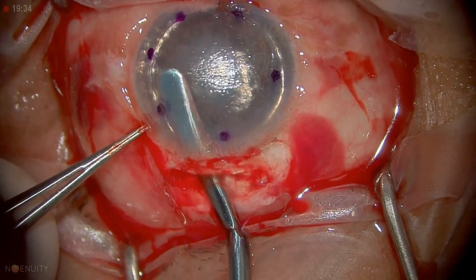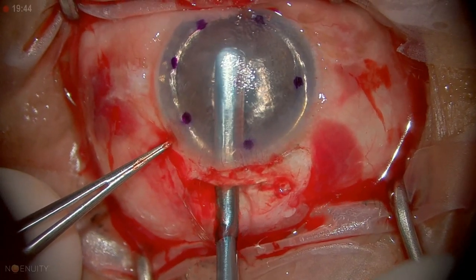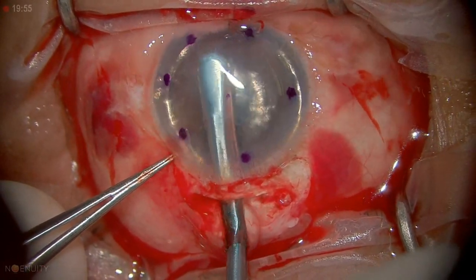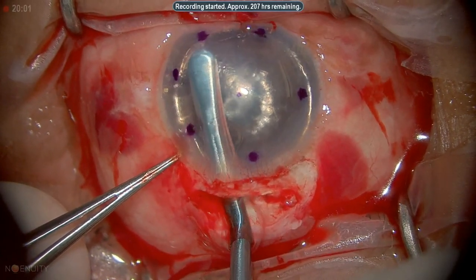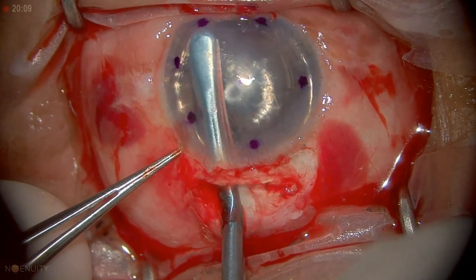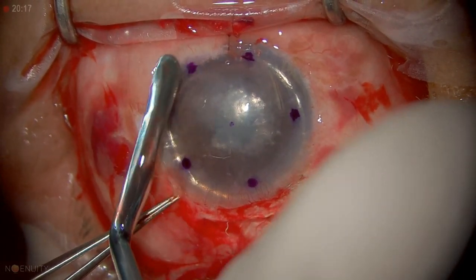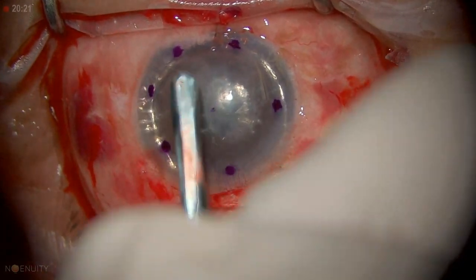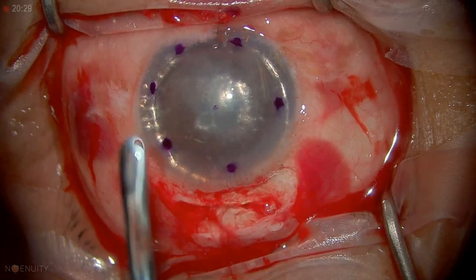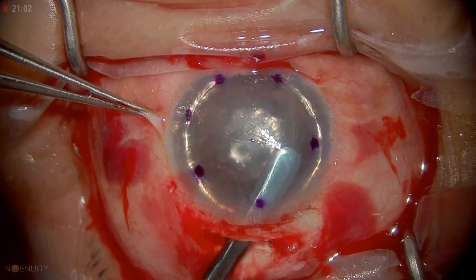You can see I'm crossing the half cornea. The dissection is going fine — just calm, doing the same thing. I want to reach across to get to the edge of that mark. The dissection is about this area; I haven't reached that completely, but I think we're going to be okay because we're going to be half a millimeter inside of this. A DALK over a PK is very helpful — less chance of rejection, less chance of post-op problems.